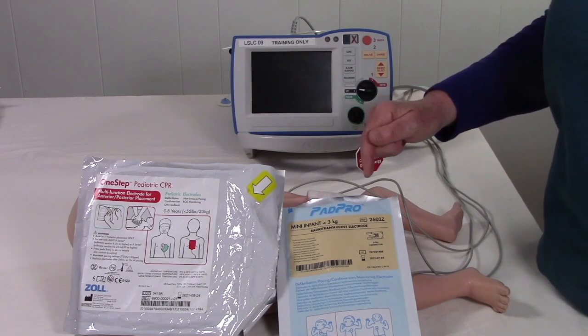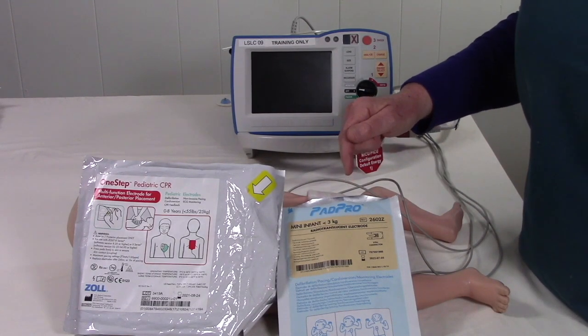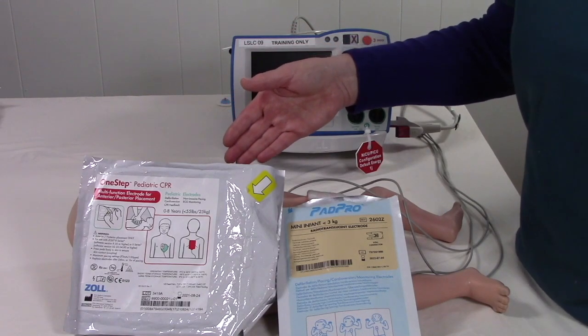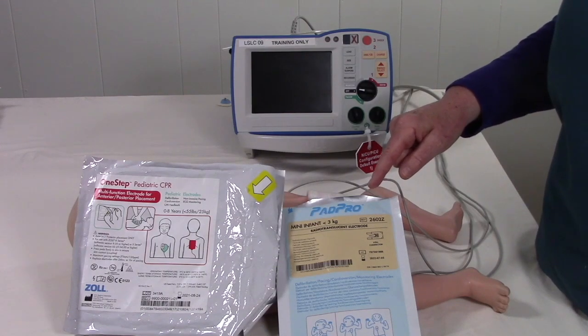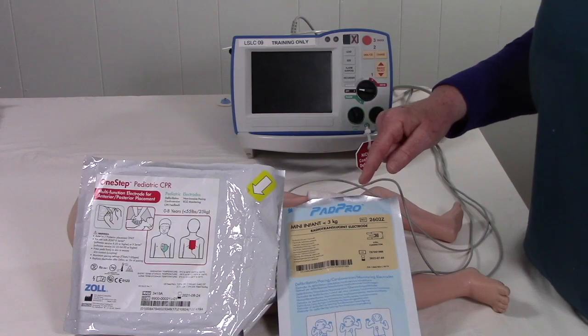For your tiny babies, you can use the Pad Pro Mini Infant pads. They take up much less room on the chest. But again, you can use the One Step for any infant in the neonatal ICU, while the Pad Pro Mini Infant can only be used for babies less than 3 kilos.